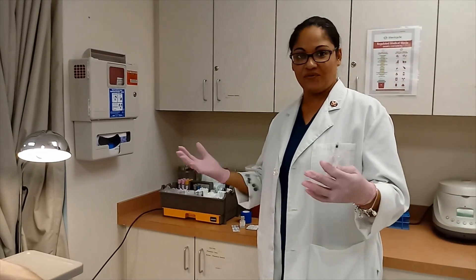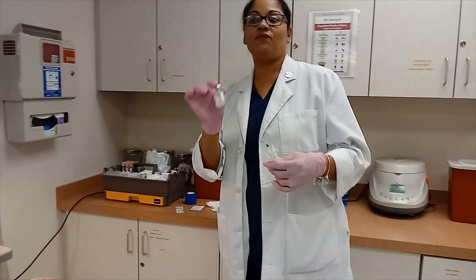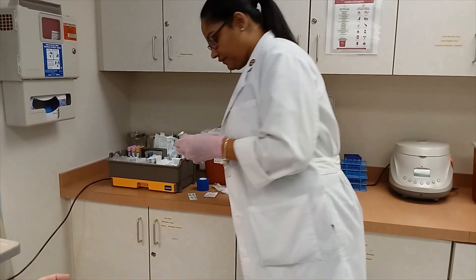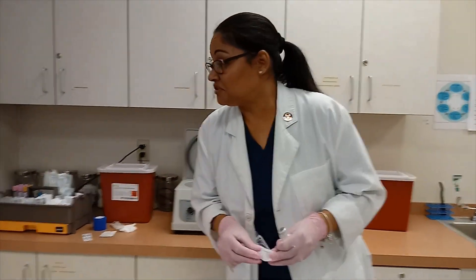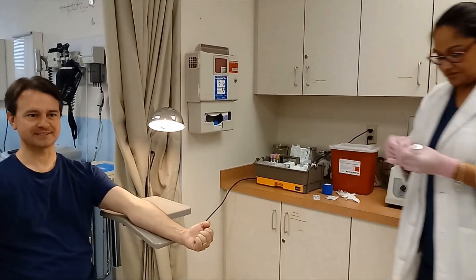If you're looking for a medication that says 'TB skin test,' you're never going to find it. We need to remember PPD — purified protein derivative. That is the medication you're injecting for a TB skin test. No matter where you live or work in the world, you are always going to draw up 0.1 mL for the TB skin test. Right dose — 0.1 mL.